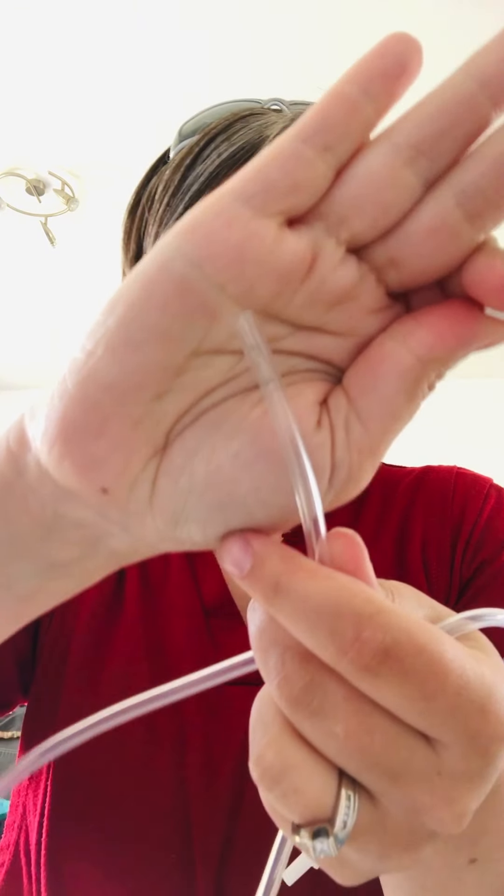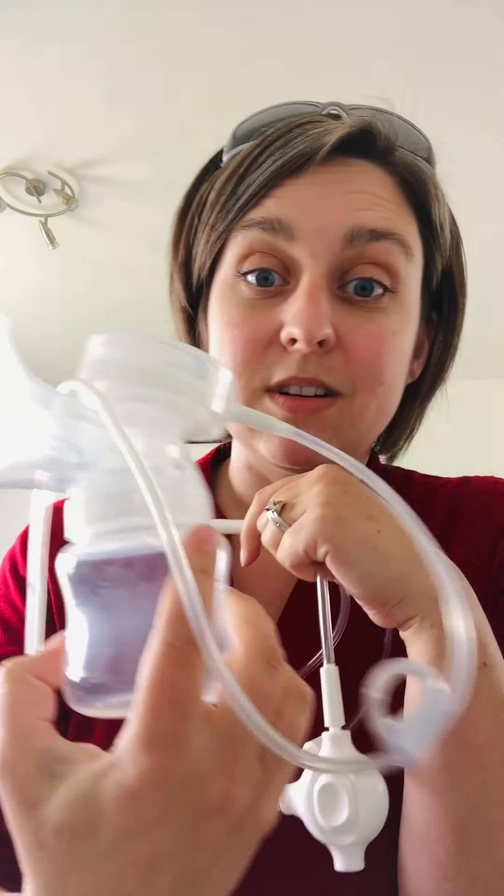Sorry, the alarm went off — gotta go pick up the kids! But anyway, you can just take this tubing off and it's really interchangeable. You can hook it to whatever you want: all the cups — Free Me, Legendary Milk, Spectra, MomCozy — all that stuff. You can also use the Baby Buddha with the Pumpables liquid shield or liquid flange kit, since it comes with totally standard tubing.